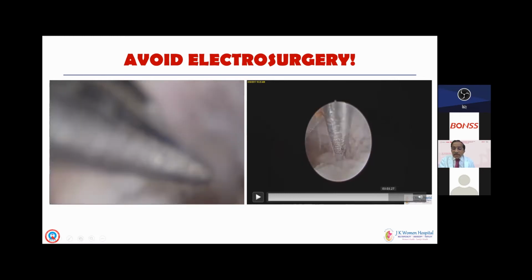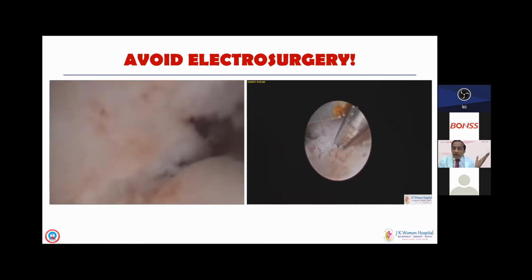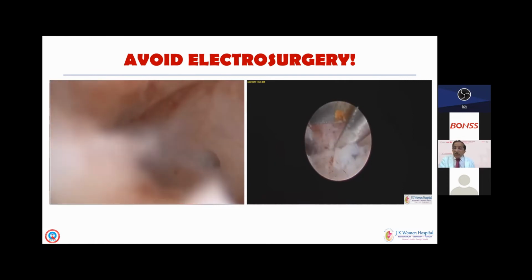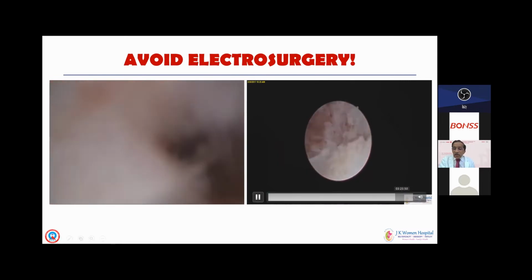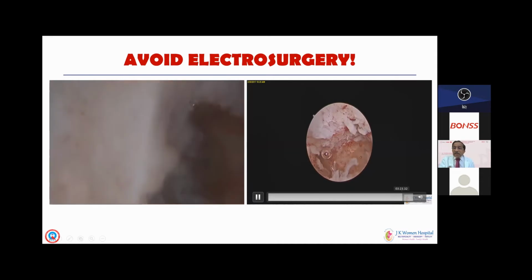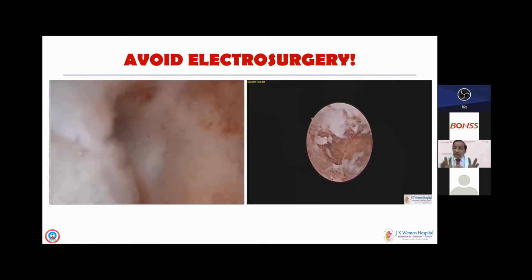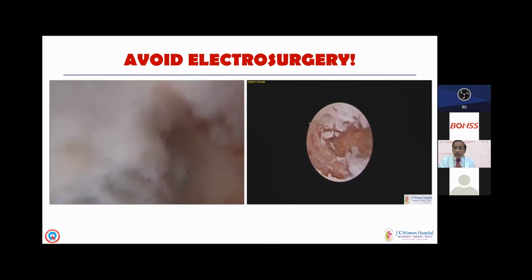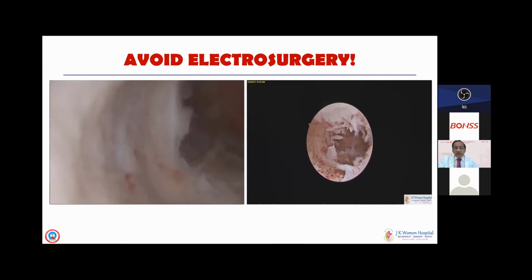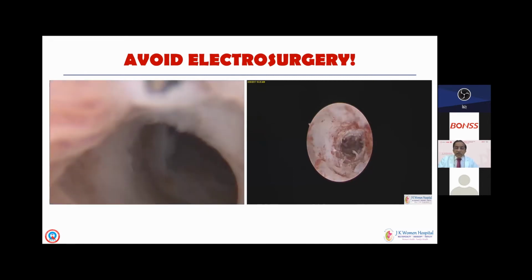And you can see that as we go on cutting, we can then go to the lateral side and do a proper cavity which is triangular shape. You may be lucky to see the tubal ostia many a time. As you can see in this case, there is good level of endometrium. Well, we have created a cavity from absolutely zero position. So this patient will do better, but this severe adhesions patient will require a relook hysteroscopy after the first procedure.